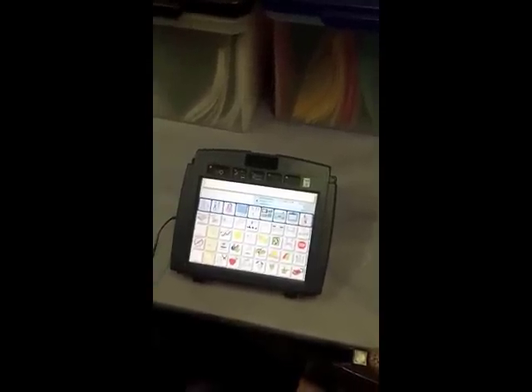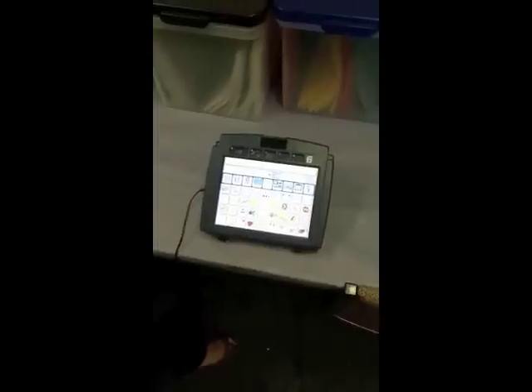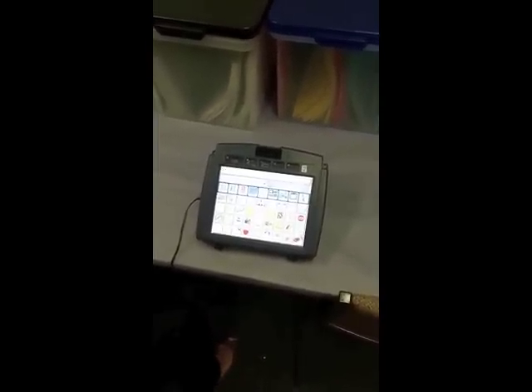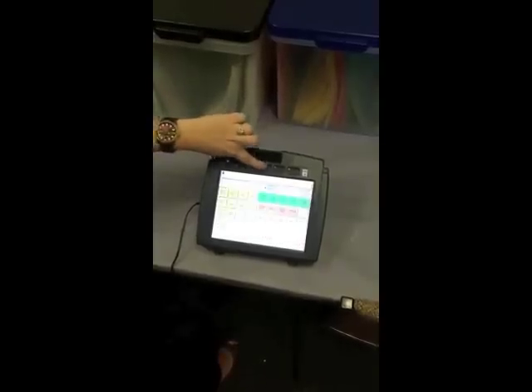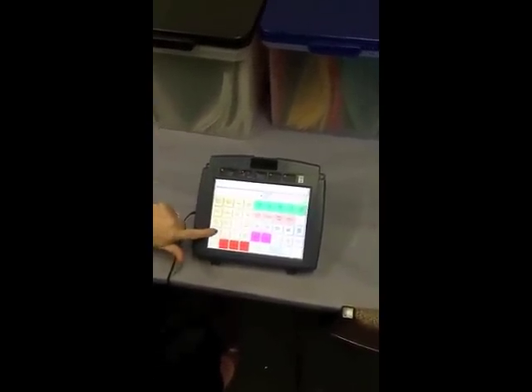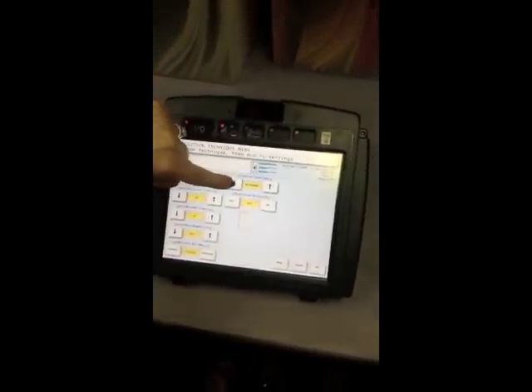When the device is charging, the battery indicator light should be flashing. Though we're demonstrating use of the Vantage Lite through direct selection, if you wanted to change the access method, you would hit the toolbox button and then go to the Selection Technique menu and change the selection technique by pushing these arrows.